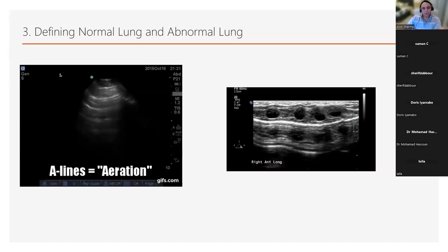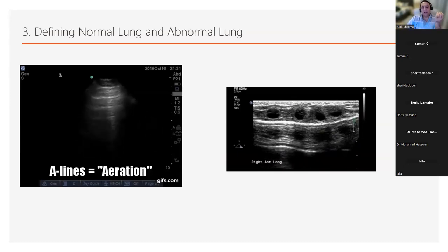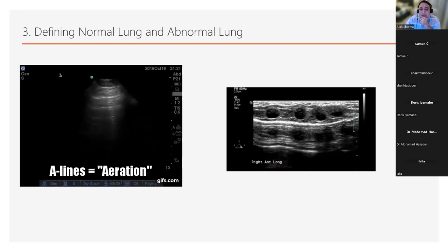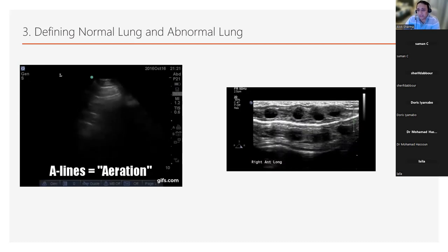But then a really important aspect is defining the normal and the abnormal lung. The reason I'm saying this is because you will have different guidelines on PICU versus guidelines for you. The way PICU might define a normal lung might be very different to how you want to define a normal lung for a baby that's just been born who's transitioning. Again, I'm giving you a simple analogy: a baby who's got settling respiratory distress with a respiratory rate of 60 with no recession, that is actually normal lung appearance for that baby at about 60 minutes of age.